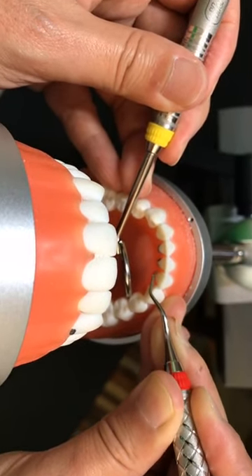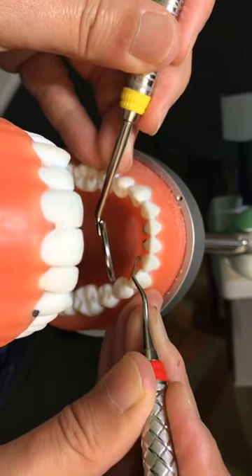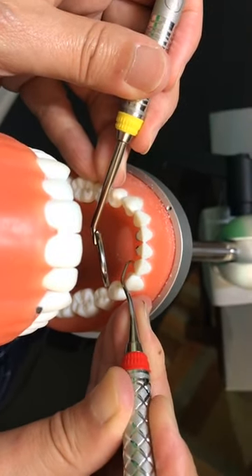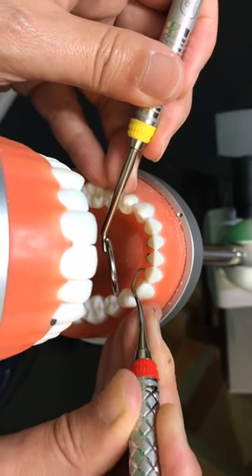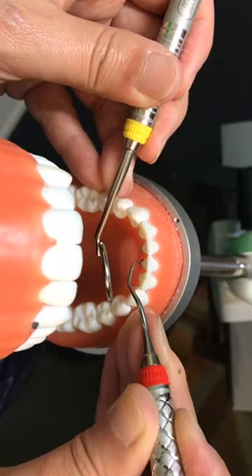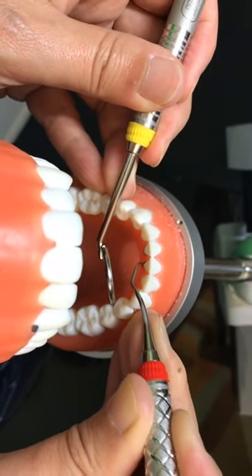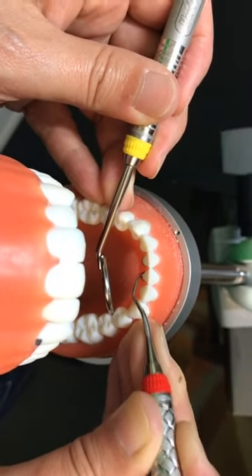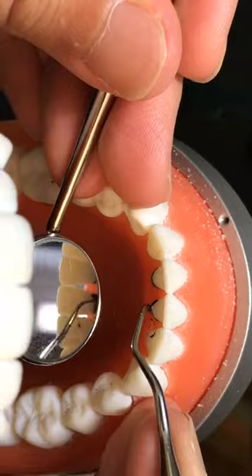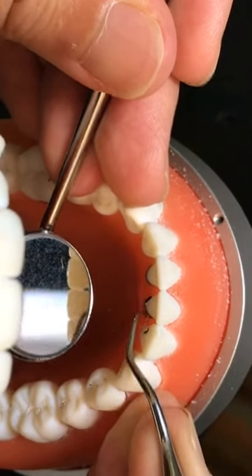The challenge with this camera in front of me is I don't get to see what I'm scaling directly — I'm seeing through the camera. Here you go. Here's a big chunk of calculus. Subgingivally go, lightly touch down to the base of the pocket, then feel the calculus and grab it. Look how it feels — how it feels good coming off. Toe down, insert, and here's this lingual calculus.